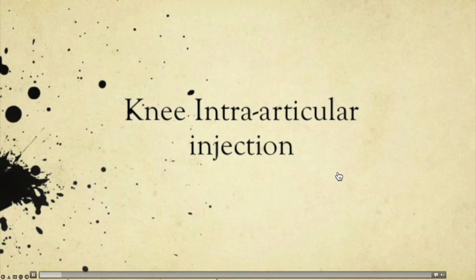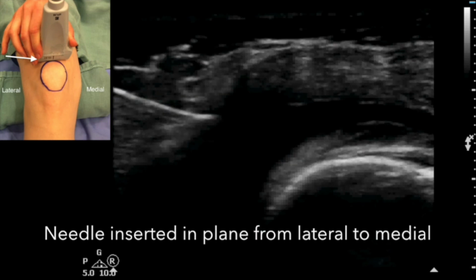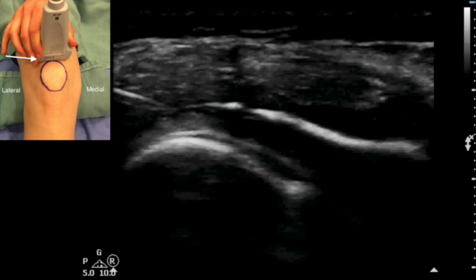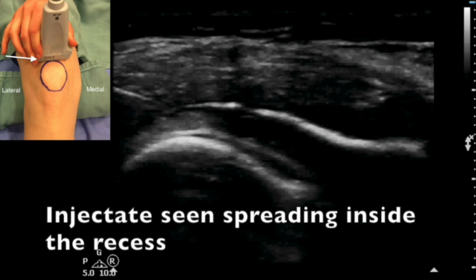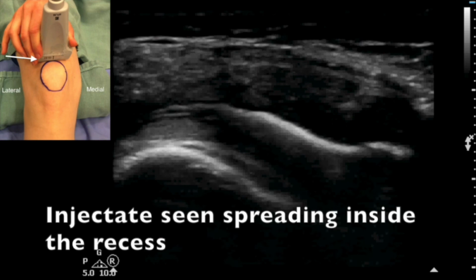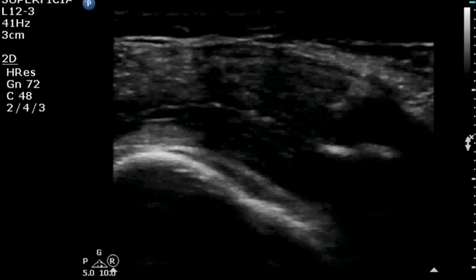This is very important because by far the common mistake when a surgeon performs what we call a blind injection is that they inject into the fat pad, because it gives you loss of resistance. So it's very important to make sure the fluid goes inside the bursa.